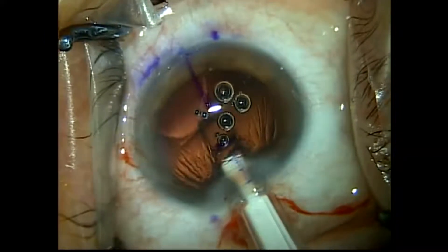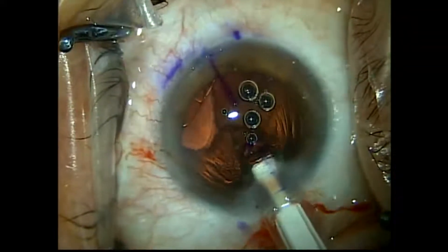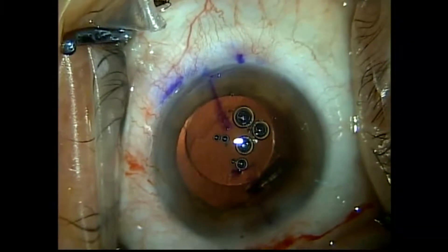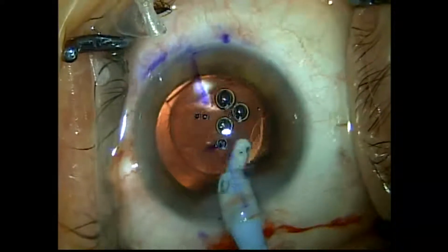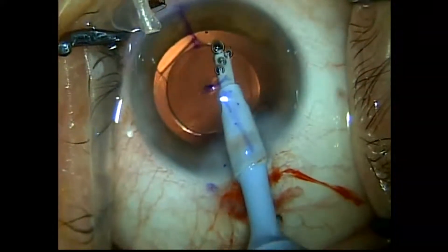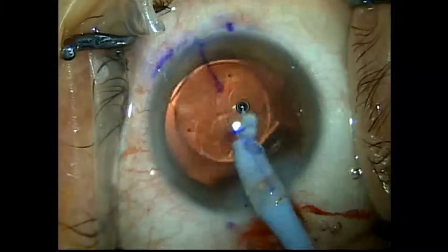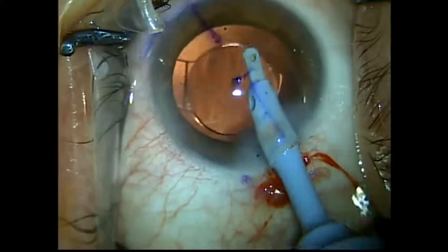I insert the leading haptics into the capsular bag. If fortunate, the trailing haptics will also go easily in — in this case that does not occur. The leading haptics are in the bag but the trailing haptics are not. I use the silicone tip IA to nudge one trailing haptic behind the anterior capsule leaflets, then rotate the lens counterclockwise to let the remaining trailing haptic go into the bag. Now all four haptics are in the capsular bag — we're pretty much home free.